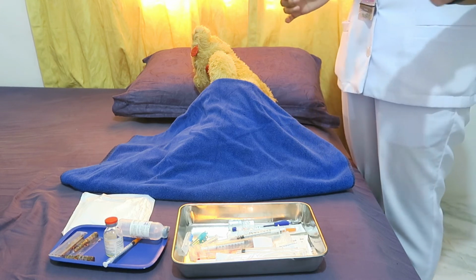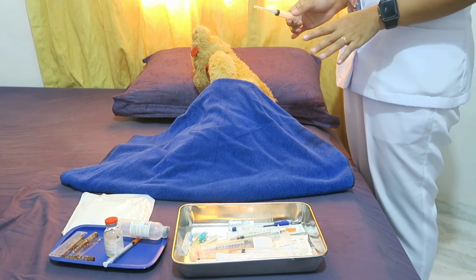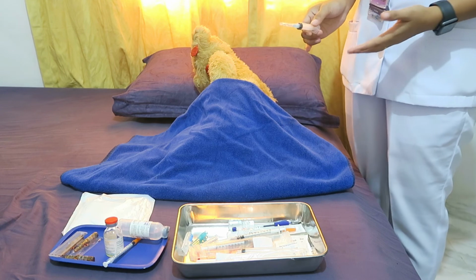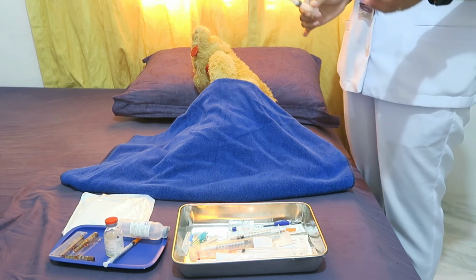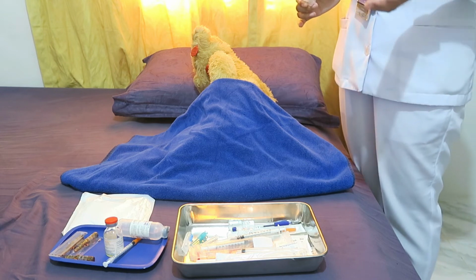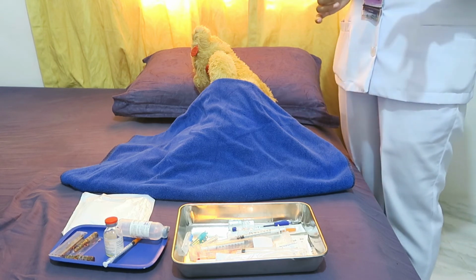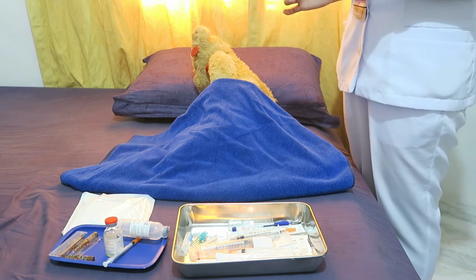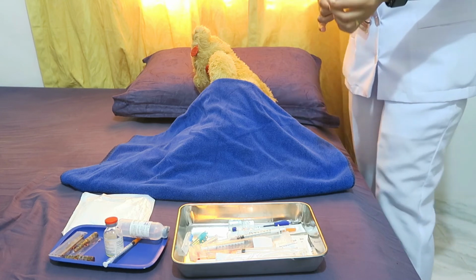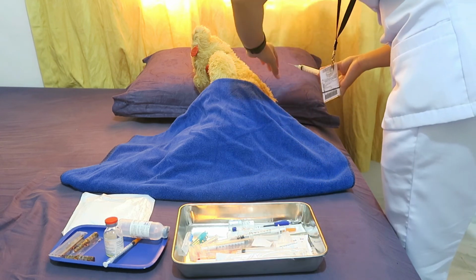If blood appears in the syringe, withdraw the needle, discard the syringe and prepare a new injection. If blood does not appear, inject the medication steadily and slowly, approximately 10 seconds, while holding the syringe steady if using the ventrogluteal site. So, let's proceed to injection. So, I will inject now.